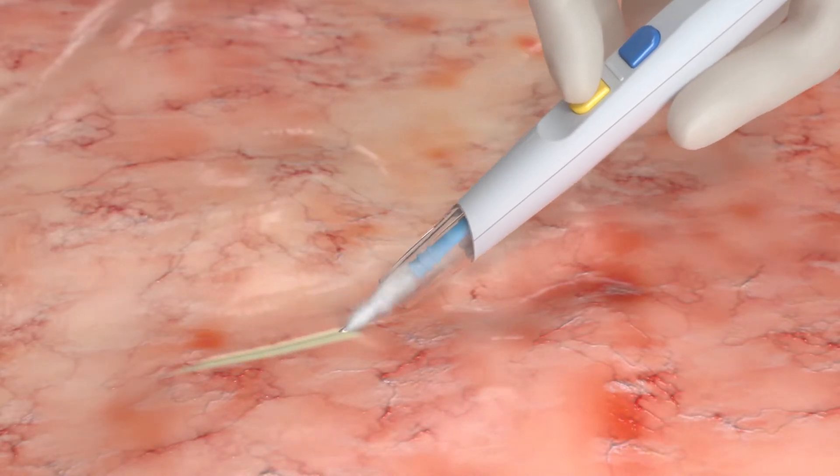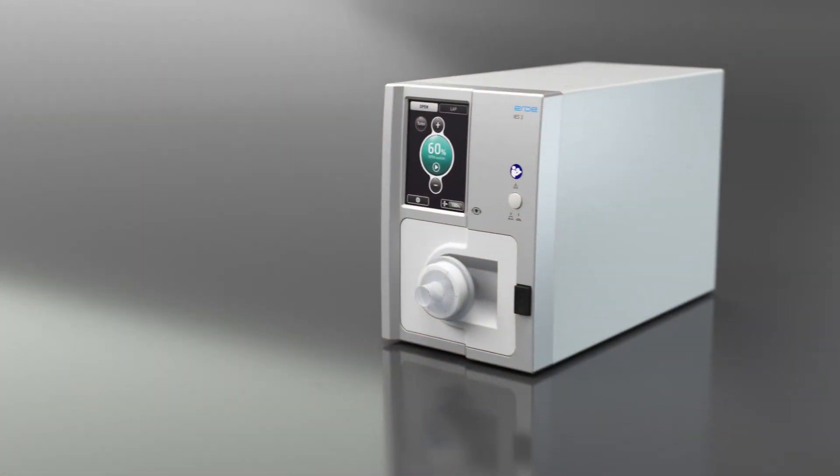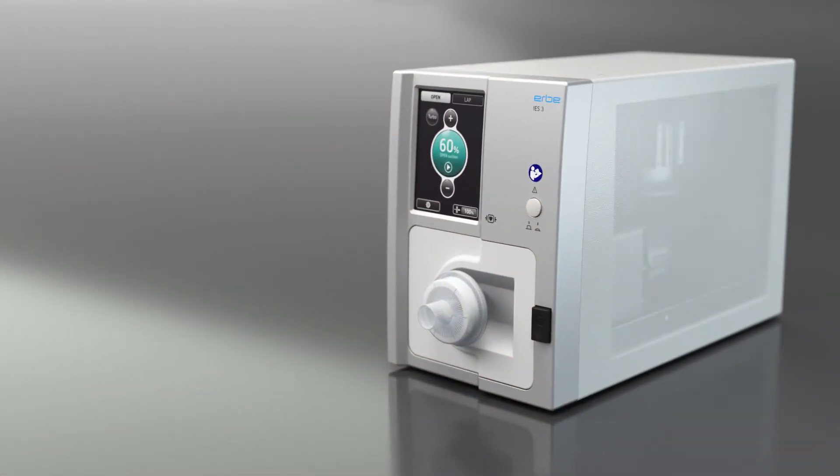This always gives you a good view of the surgical field and of the surgical site itself. The bi-turbo technology of the IES-3 ensures fast evacuation without any delay.